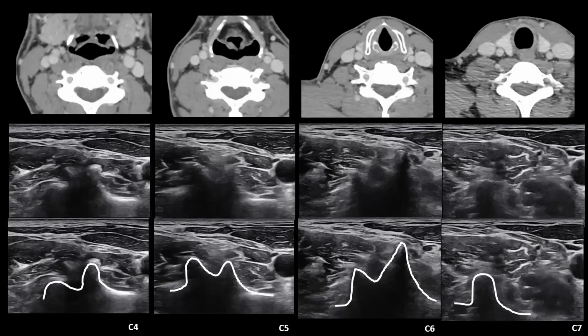On thyroid US, you can see the transverse process of C4 to 7 in the lateral neck. As I told you, the most prominent part on US is the anterior tubercle of C6. Posterior tubercles are placed deeper, which makes them hard to see on US.